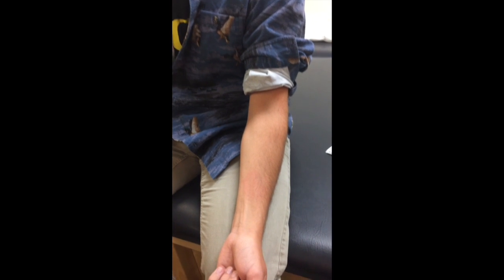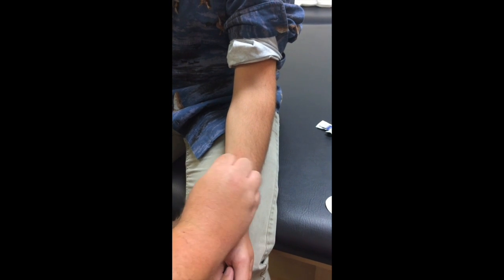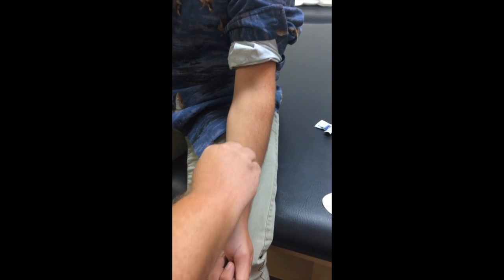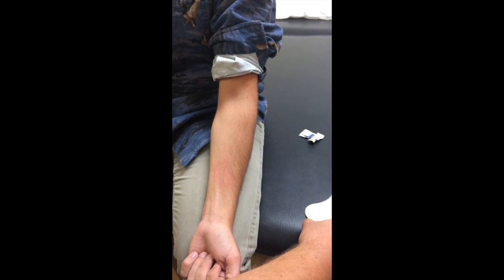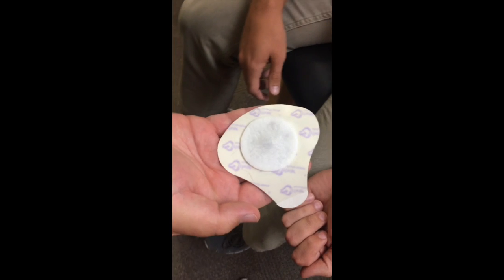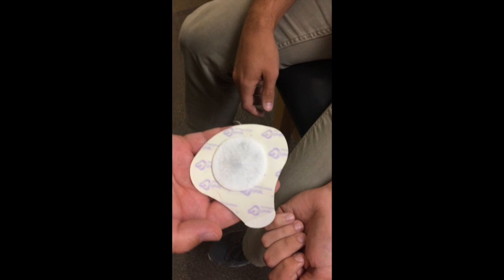Before we start our treatment, we're going to screen for contraindications and precautions, and explain to the patient what it's going to feel like. Before we place our pads on, we want to clean the area where the pads are going to be applied. And then we will inject the pad with the medicine. The medicine will go right in the middle pad, and then that will go onto the skin.